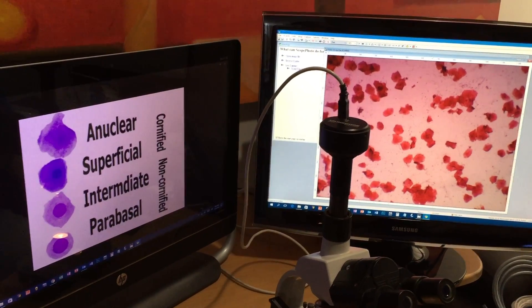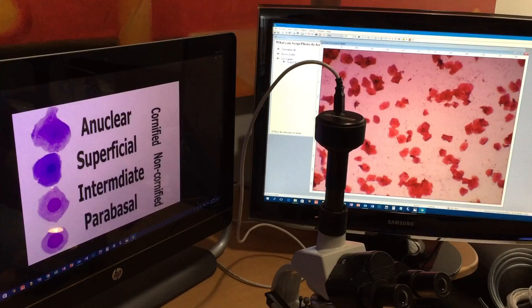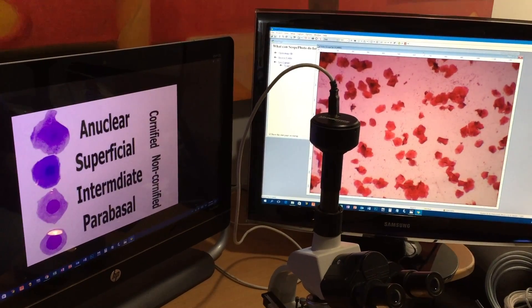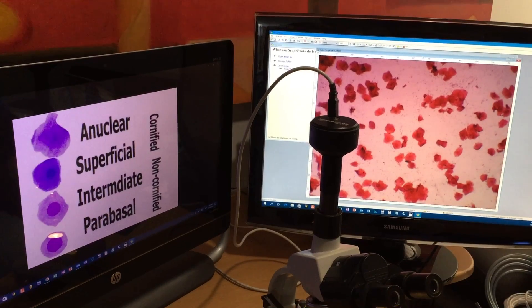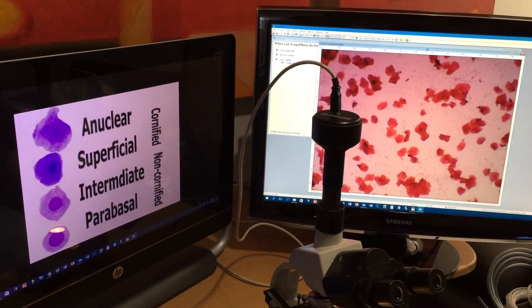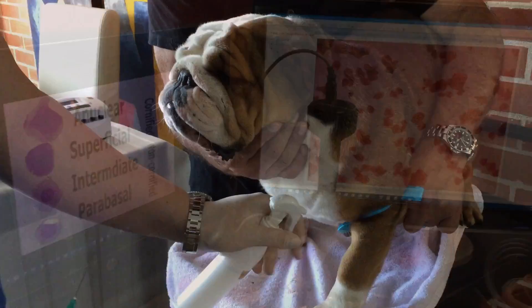According to progesterone levels yesterday she was at 2.47, so she's not ready yet. We're looking for 5 nanograms, which is ovulation, and after that we'll continue. Alright, let's go do the progesterone. Okay, so we're gonna collect the blood for the progesterone. You want to clean the area really well.